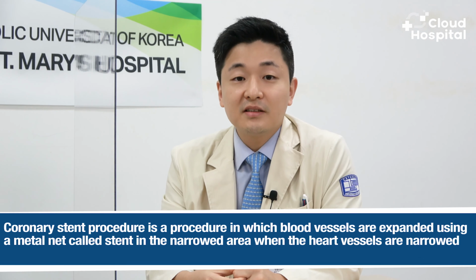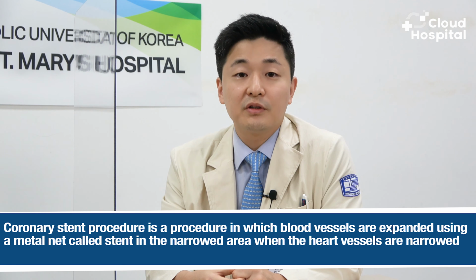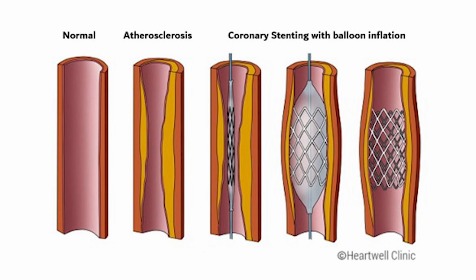Coronary stent procedure is a procedure in which blood vessels are expanded using a metal net called a stent in the narrowed area when the heart vessels are narrowed. Insert a long tube through a wrist or leg vessel. Position the tube at the entrance of the cardiovascular system and insert a stent through it. And proceed by expanding the stent placed in the narrowed area.